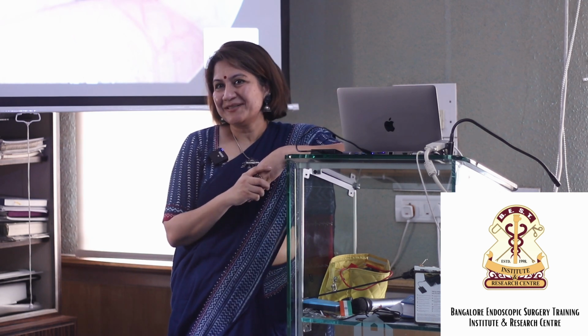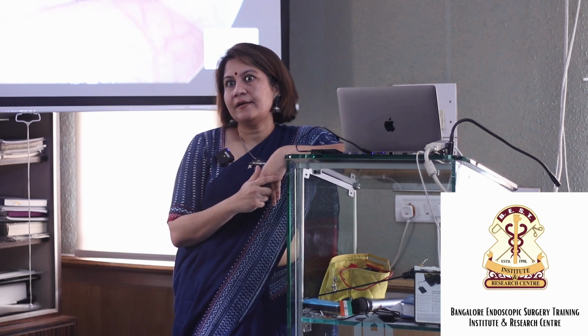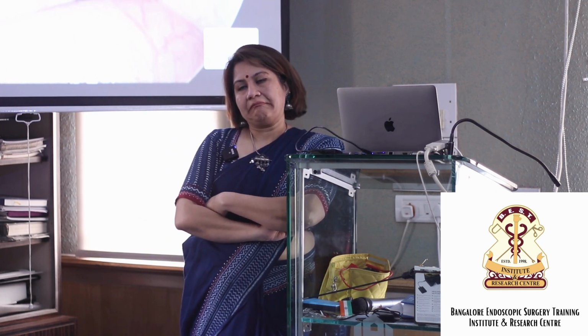What is there in AV will be monopolar only. We have bipolar, we don't have... When did you change? We don't have a monopolar system at all. I don't know if it was before. It was there till very recently. Madam bought the bipolar hysteroscope. That's my little reason. In the COVID days I missed 2 years. I've not come for surgery for a long time. So when we were there, it's exactly the same.